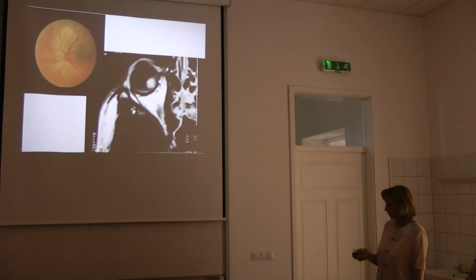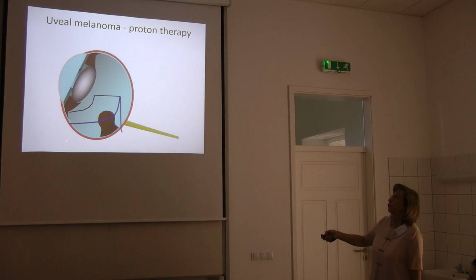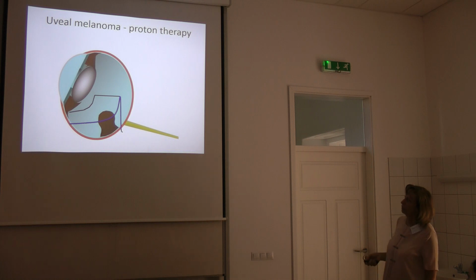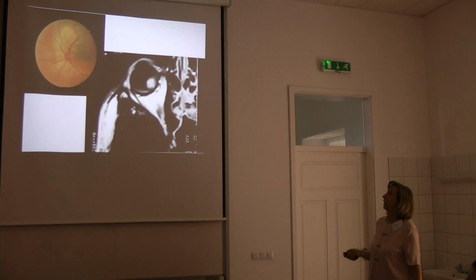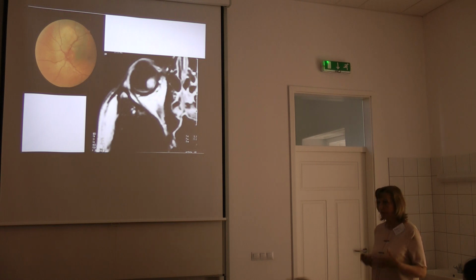And in that case, you can see that if we consider one single proton beam with a certain enlargement of the Bragg peak, it can be used very easily. And this was the technique which was really introduced more than 30 years ago, and we have experience with several thousands of patients with that.